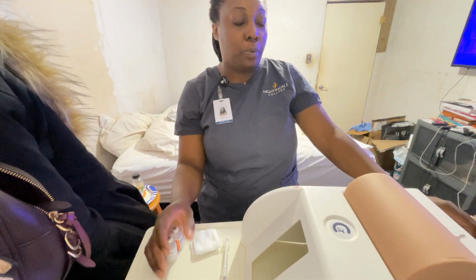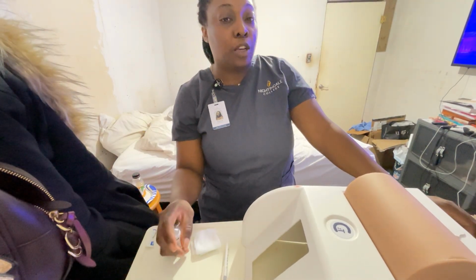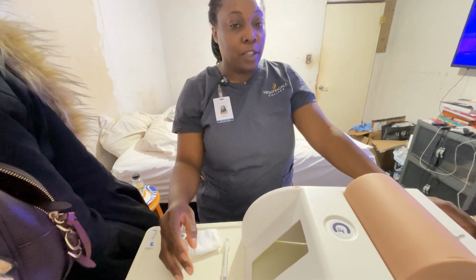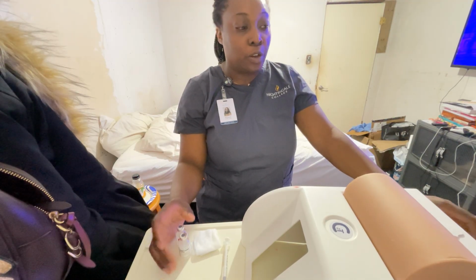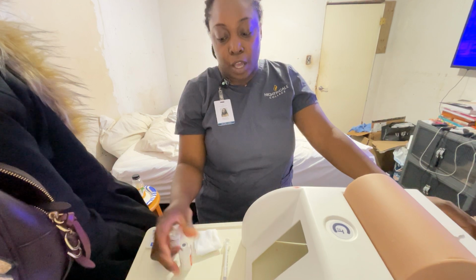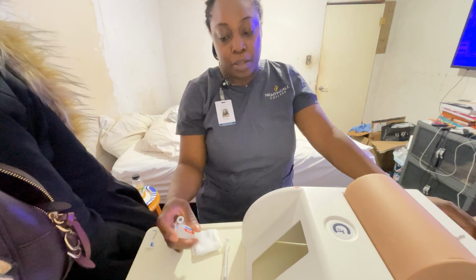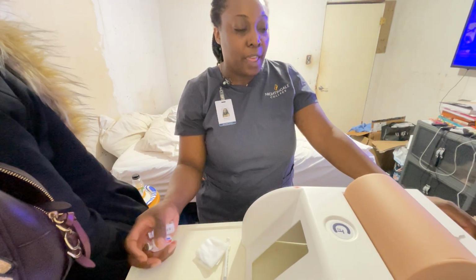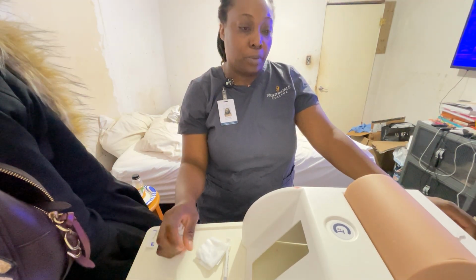So prior to me administering these medications, I'm going to check your blood sugar to ensure that your blood sugars are within the appropriate levels. If they are not, such as if they're too high, I'm going to give you 4 units of the regular insulin and then 8 units of the NPH insulin, which should be a total of 12 units. And then after you receive your insulin, if you need it, you'll receive your breakfast tray in about 30 minutes.